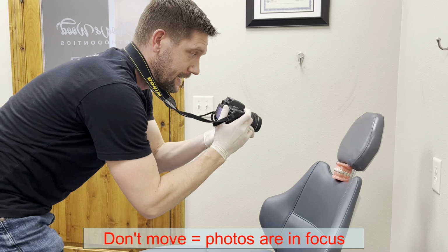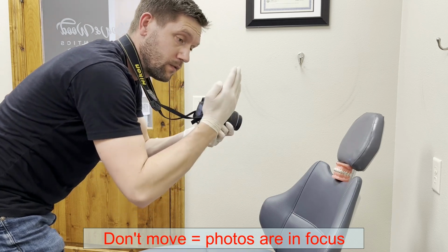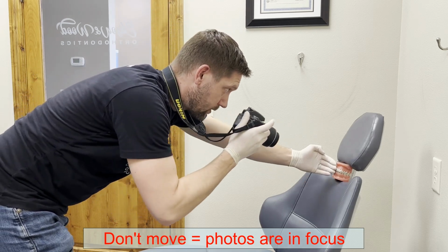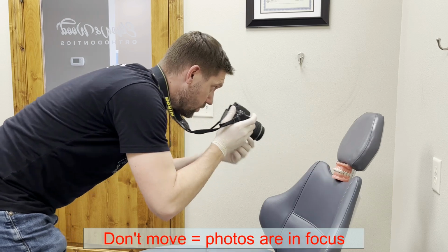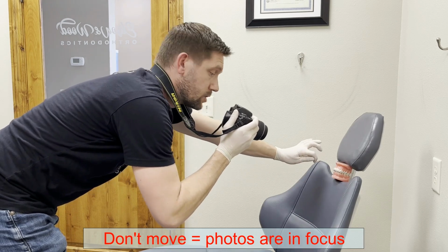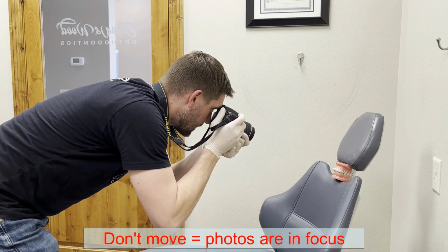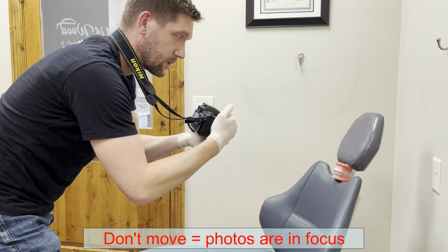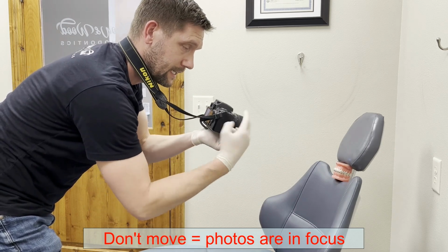From when you push that button and it beeps to when you take the photo, you don't want to move anything, because when it beeps, that means that thing it beeped on is in focus. So now if you move forward or back, that plane of focus moves with you. So if you get all set up and you focus it, and then you say, oh, move your little thing here, just take your finger off, get everything perfect, get reset up, focus, and then take the shot. Between when you focus it and when you take the shot, you don't move, the camera doesn't move, the patient doesn't move, nothing moves. If anything moves, just take your finger off and refocus and then take the shot.